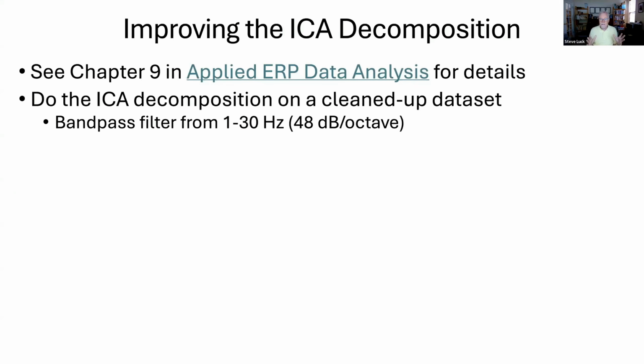When ICA was done without this optimized version, about 20% of the subjects couldn't be kept. Using the cleaned up version, like 99% of them could be kept. So you definitely want to do this. It definitely works much better.